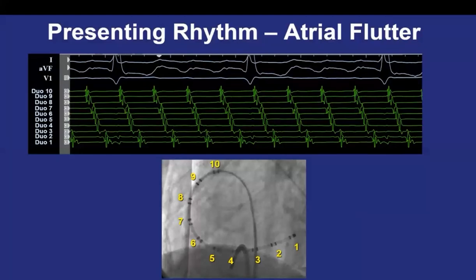How to differentiate the atrial tachycardia and the tracing? Okay, I don't have the atrial tachycardia now in my slides, but generally speaking, there are a few things to keep in mind. One, always concentrate on the surface ECG. Always. The surface ECG is a very important part of your assessment in the EP lab. Don't concentrate on the intracardiac while forgetting the surface ECG.